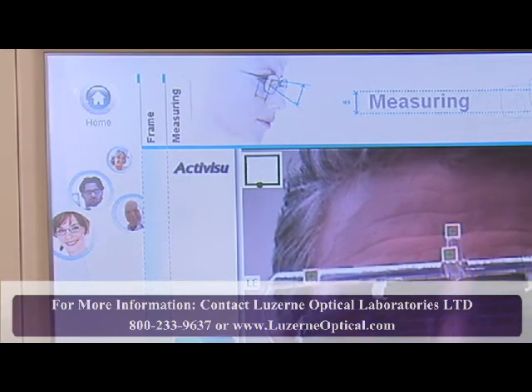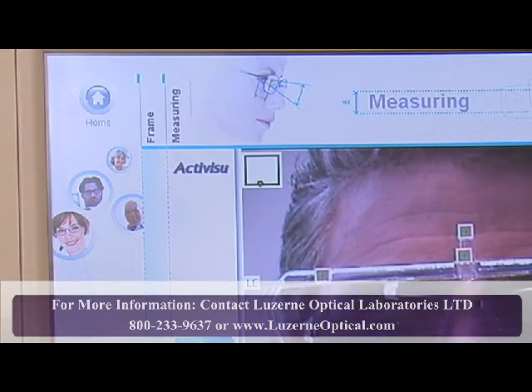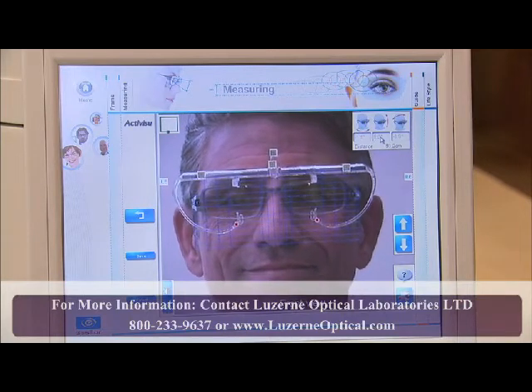The VisiOffice system will alert you if the patient is too close or too far away from the mirror. Have the patient look directly at the bridge of their nose in the mirror and click on the video camera icon.